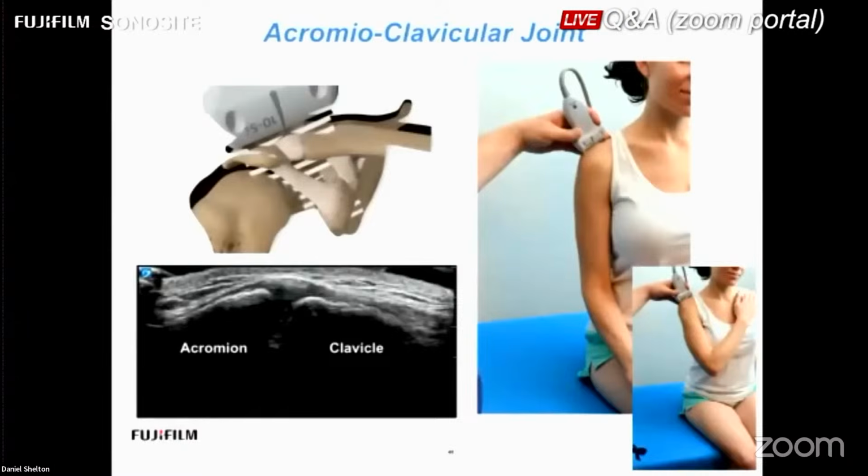You can also stress the elbow by pulling down on the elbow and do kind of a weight-bearing exam on the AC joint. That can be helpful for AC separation, just checking out the stability of that ligament again, and seeing if the joint opens up or gaps.